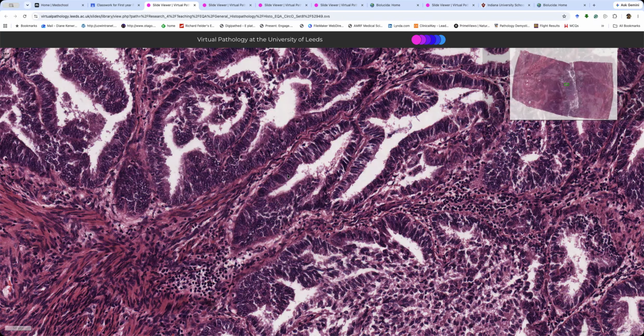Endometrioid glands have a look to them, and this is the look. The cells are all lined up, pointing to the middle, and the glands, I'm going, the Kiwis in here will understand this, they are a bit like Lake Wakatipu. Okay, so here we've got Lake Wakatipu. All right, it's got some arms as it goes in and out. It's got like the Frankton Peninsula popping out.